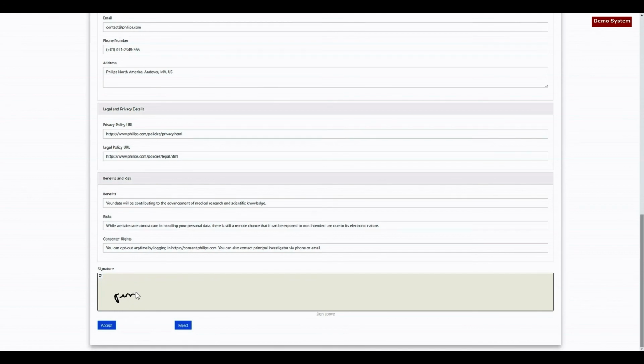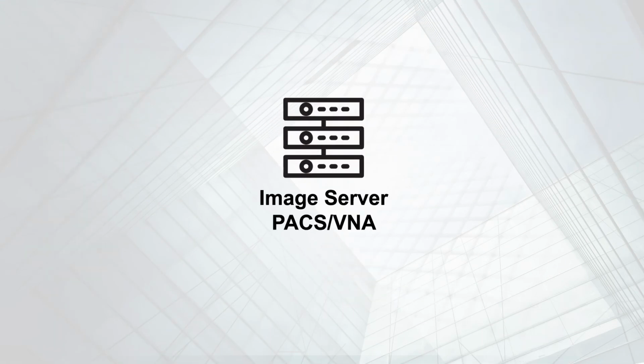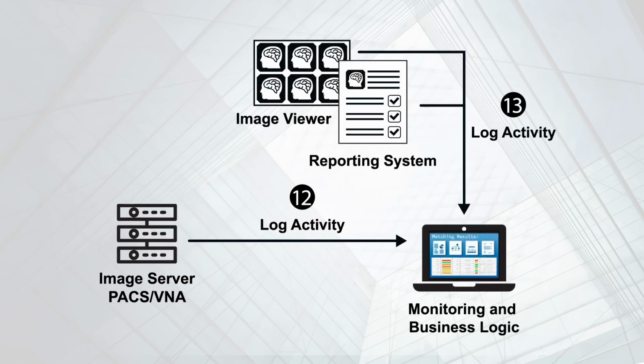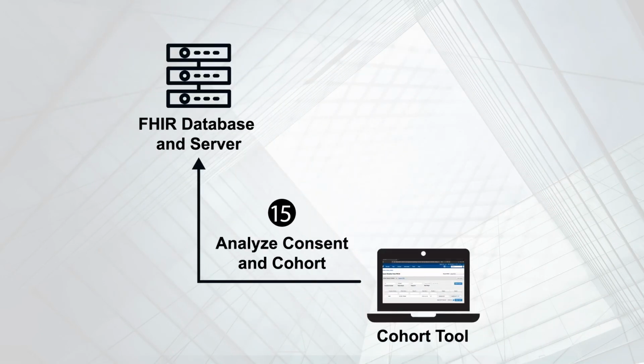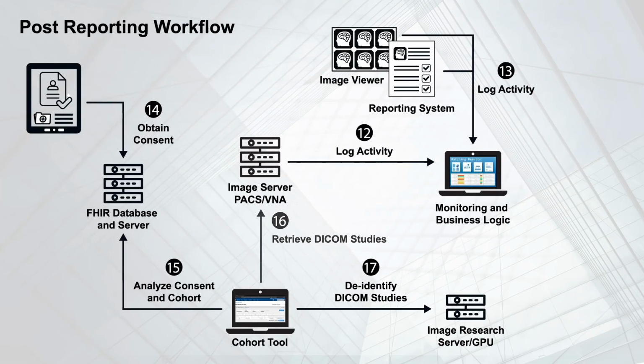regulations and institutional policies. Moving on to the process of future AI development, there has been a lot of data generated from this patient's journey, including images, imaging metadata, and classification outcomes. And now is the time to get everything organized to be able to train and fine-tune AI models.